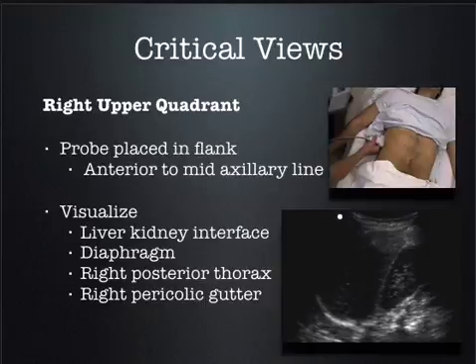What's above the diaphragm? Lung. But it's also the thorax. So fluid collects here at the diaphragmatic spine junction, right? This is the costovertebral angle right here. So fluid collects here. So a hemothorax or a pleural effusion will show up here. Right? So you just diagnosed how to look for fluid in 2 body cavities with 1 view.